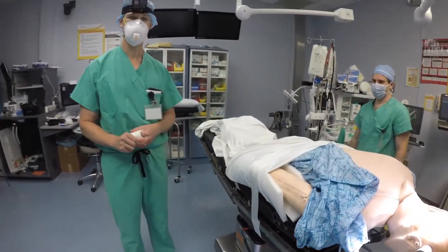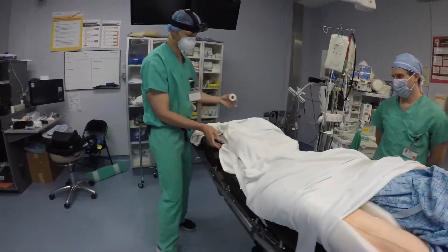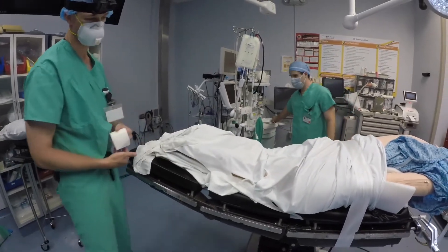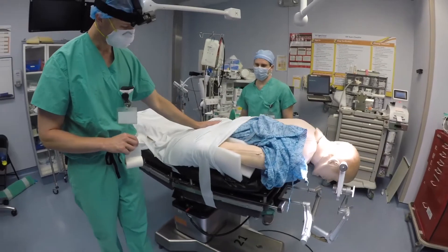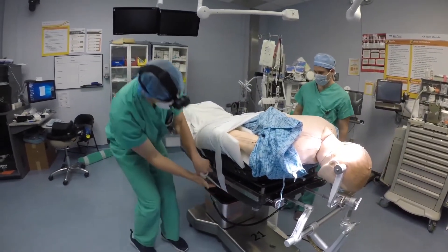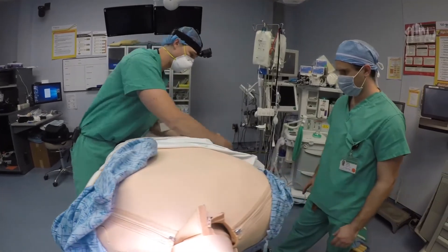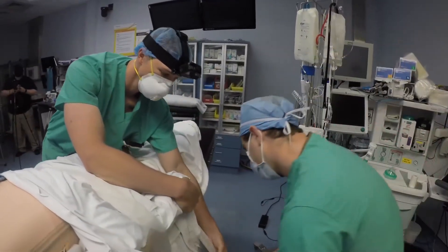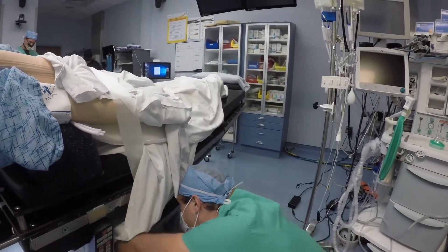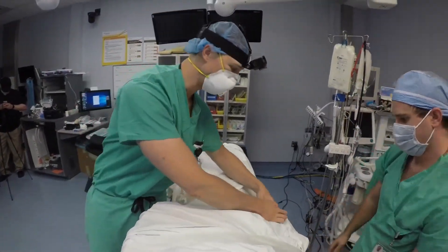A couple more points about the prone position: you want to make sure that the leg of the bed is up so the patient's knees can flex and he is well supported, with foam or a pillow underneath the calves and the toes not resting directly on the bed. In order to secure the patient at their center of mass, you can use the bed strap or tape to create a strap — avoiding the hand — letting it go under and support the upper thigh and buttock of the patient, then continuing around the bed. This is a really good secure spot at their center of mass.